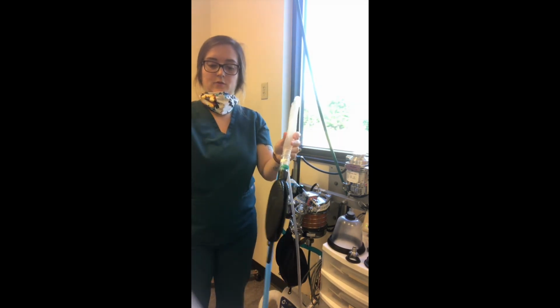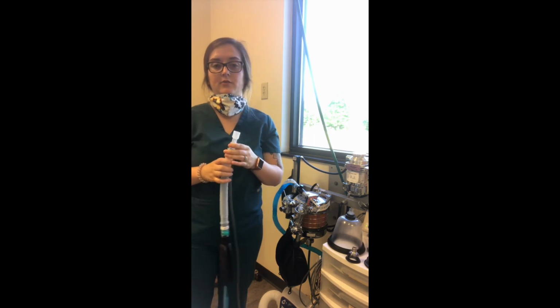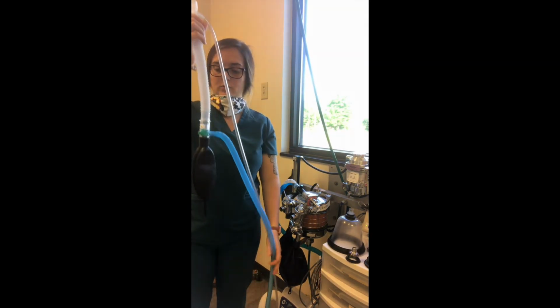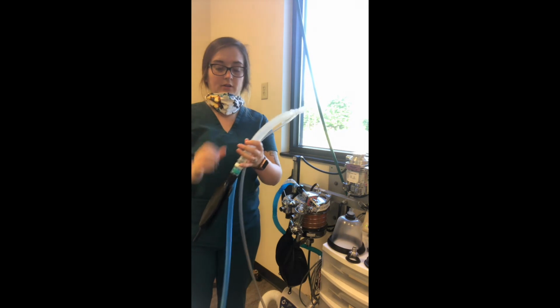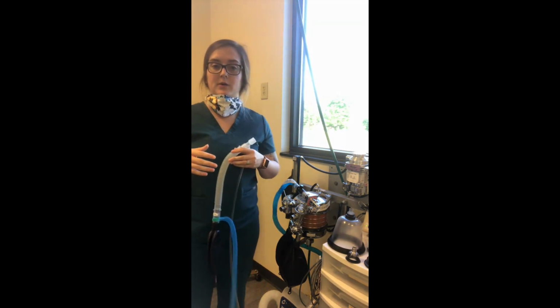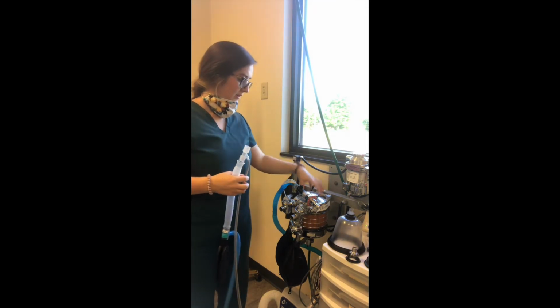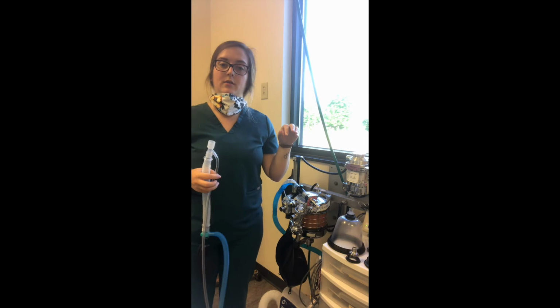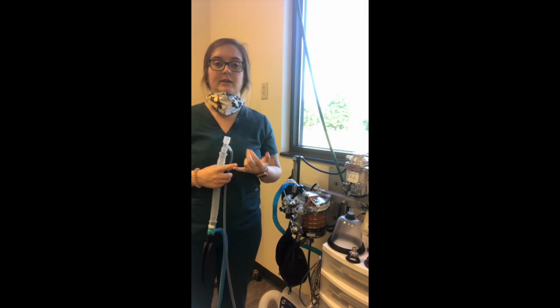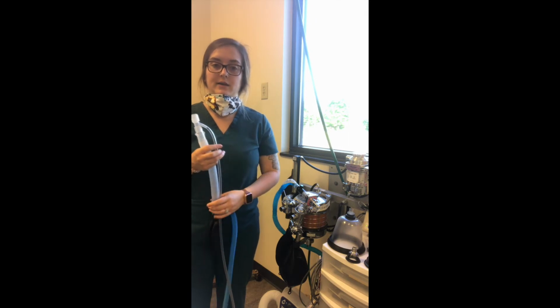We use this for smaller patients, usually anything under 15 pounds. This just makes it easier for the patient, less workload on them. It bypasses the system here, and each breath that they take has clean gas and clean air. They're never rebreathing the same gas that they have exhaled.